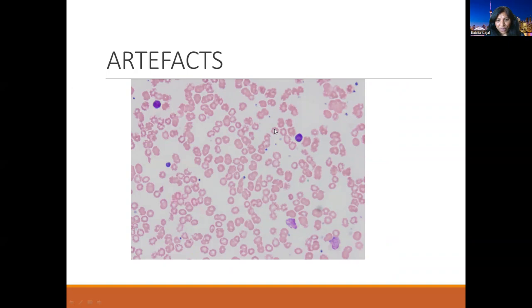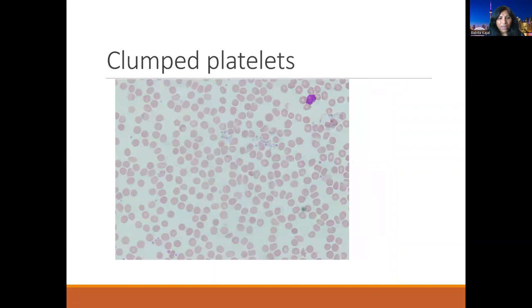Compared to the previous normal film, if we look at this film, it looks quite abnormal. First, look at these RBCs — they have large central pallor, different shapes, and different sizes. This is a large platelet. These are faded cells, probably smudge cells — so this is probably an artifact. We need to make another slide to confirm these findings. This is the problem with EDTA: here we have clumped platelets. Before calling thrombocytopenia, compare your findings with the CBC and make sure these are due to EDTA rather than actual thrombocytopenia.